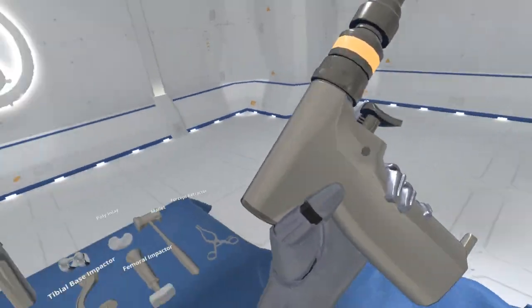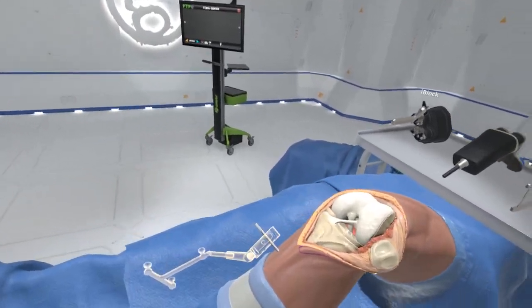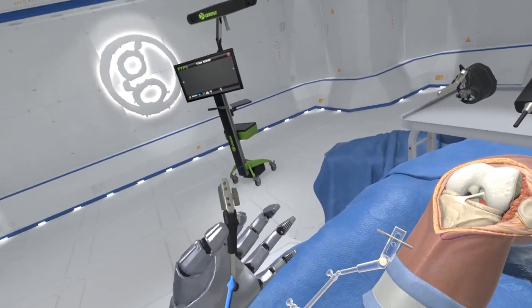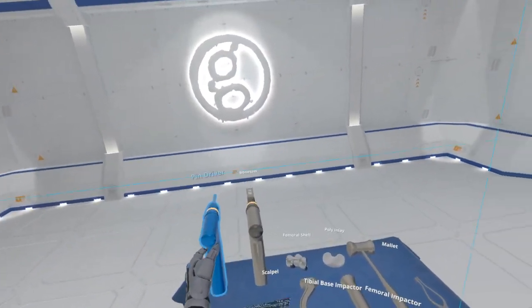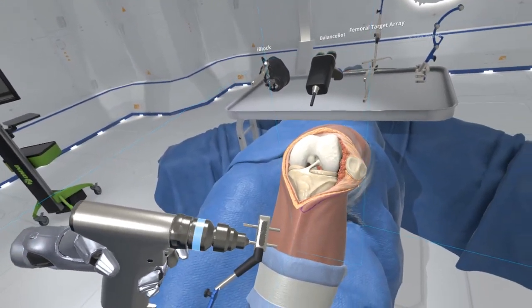Select the tibial target array already mounted to the universal 2-pin fixation block. Place it over the anchor pin you previously installed on the tibia. Grab the pin driver. Pull trigger to install the anchor pin and secure the tibial array to the anterior tibia.